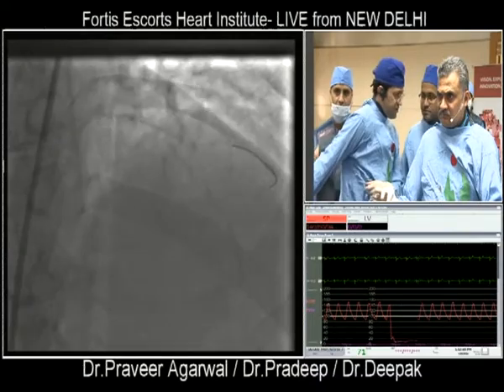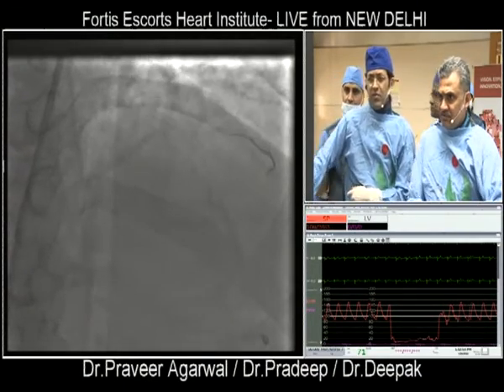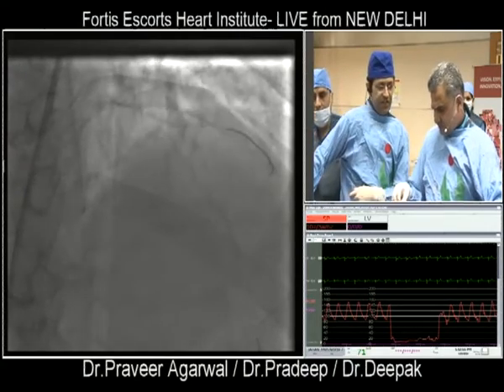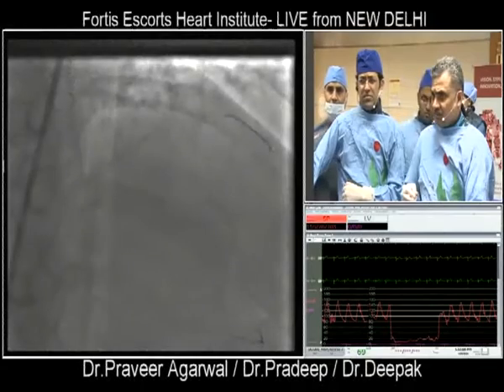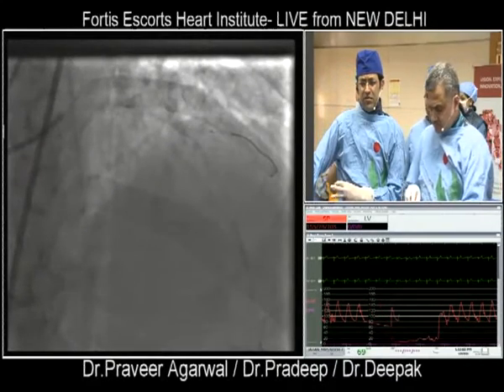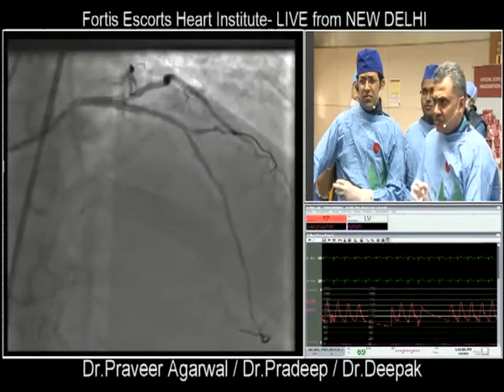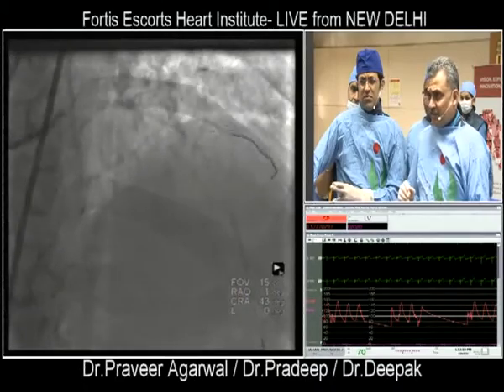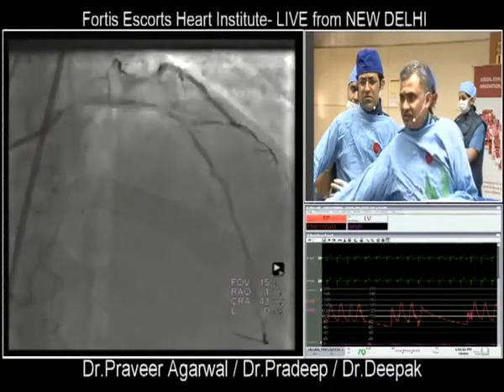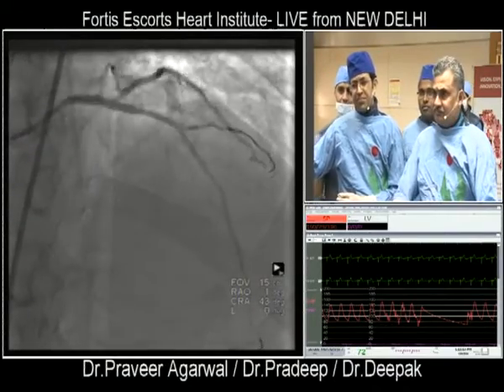Is it good now, distance? 10 minutes. That is around 40 millimeters. So now let us skip now. How much is the distance? 40, 40 millimeters. 39? The distance between the two stents is about 39 millimeters. How much? 39. Okay.